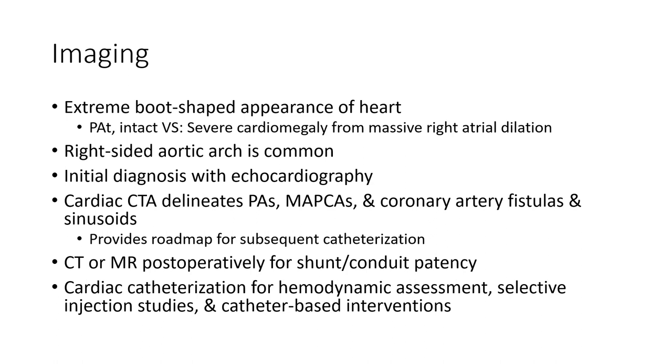Initial diagnosis with echocardiography. Cardiac CTA delineates PAs, MAPCAs, coronary artery fistula and sinusoids, and provides a roadmap for subsequent catheterization. CT or MR postoperatively for shunt patency. Cardiac catheterization for hemodynamic assessment, selective injection studies, and catheter-based intervention.